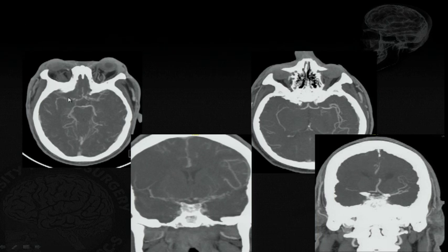The MCA is occluded, but there's all this cluster of blood vessels around it. Moyamoya, thrombus occlusion, acute occlusion, moyamoya. There's no MCA, that's for sure, but there are all these perforating vessels that are hypertrophied.